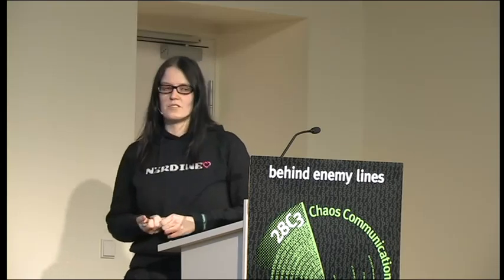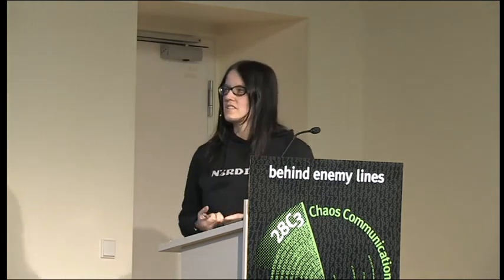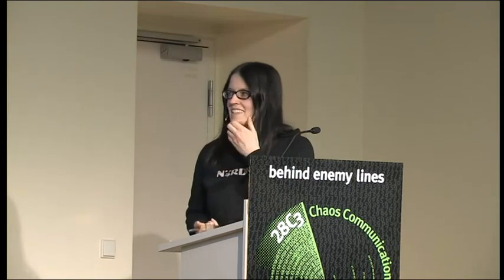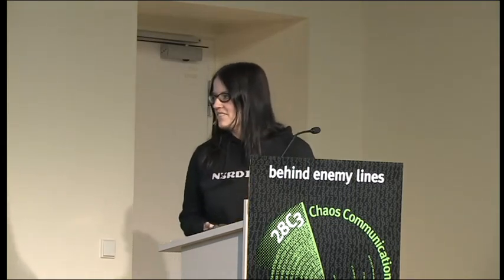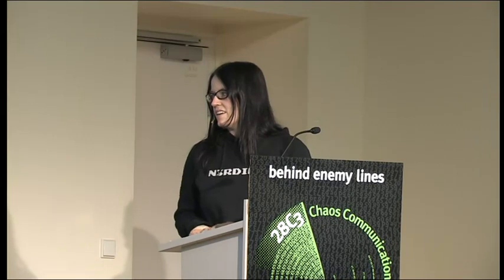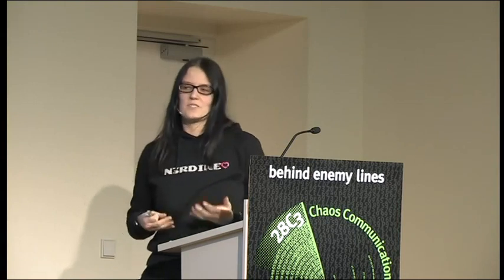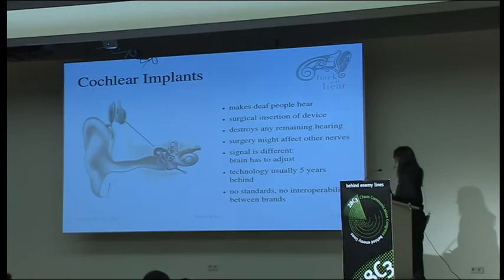The brain has to adjust to that for very long. There are actually hearing courses after you get the surgery and the device started. You have to really get used to that, because, I mean, it's like electrical signals directly inserted. And the technology of these devices is usually behind the usual hearing aid technology because it has to be well tested before you put something into your head.